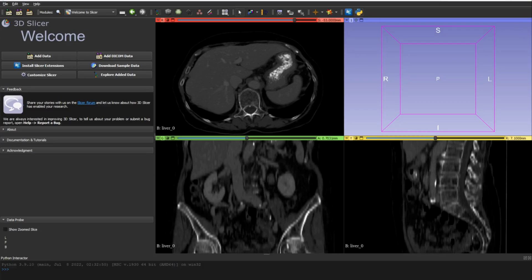Hello everyone. In this video I will show you how you can do 3D segmentation in CT scans, MRIs, or any type of 3D medical imaging scans using 3D Slicer. I'll show you how you can do that manually using multiple tools. For example, I have this CT scan here opened.